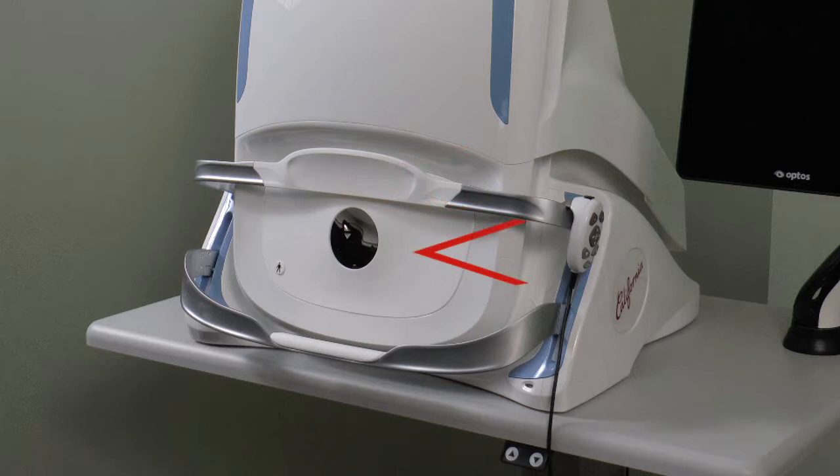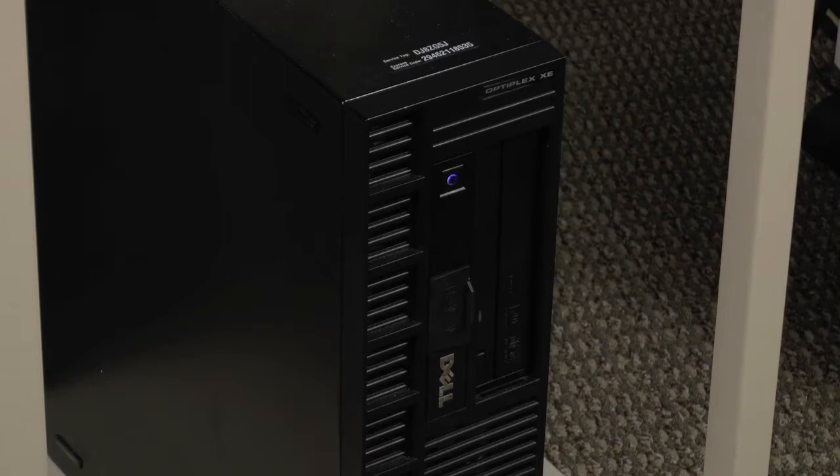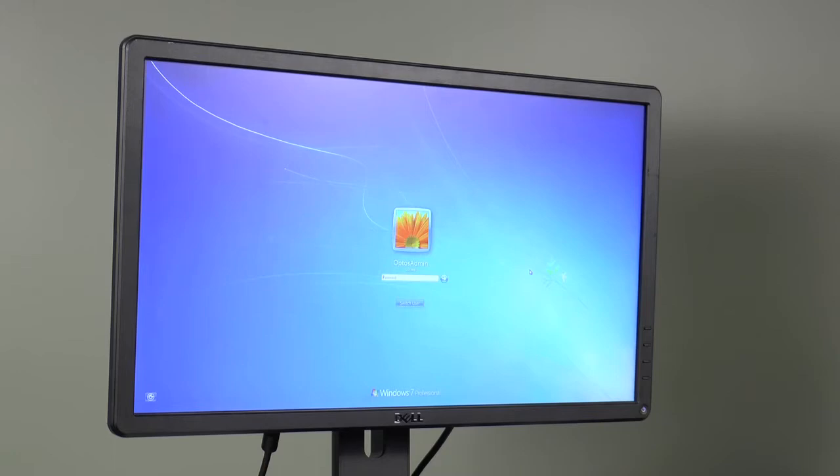The table height adjustment buttons are also present. The server, which stores patient information and image files, should be on before starting up the California, but does not require login to be available to the scan head and viewing PCs.